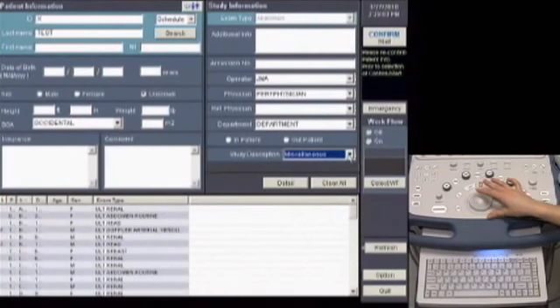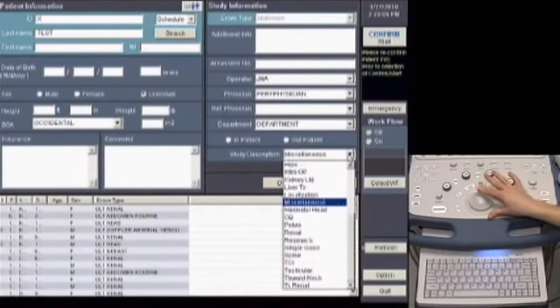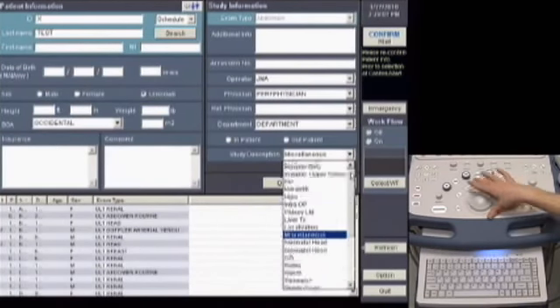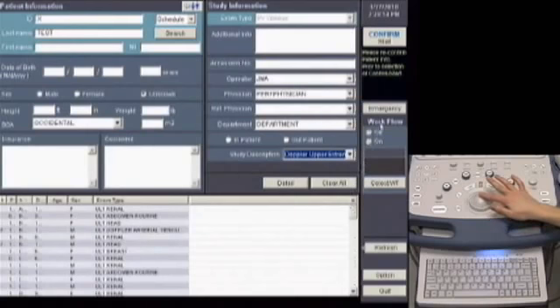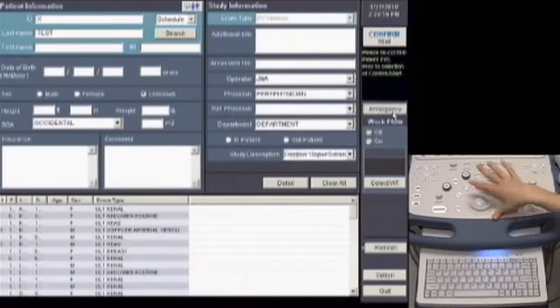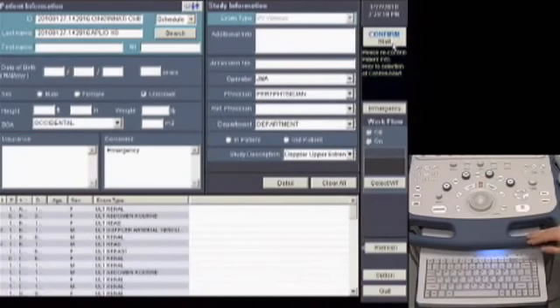Then we're going to select our study preset using the drop-down menu to select Doppler Upper Extremity, and use set to select it. Again, select Emergency, and then use set to select Confirm or Start to begin the examination.